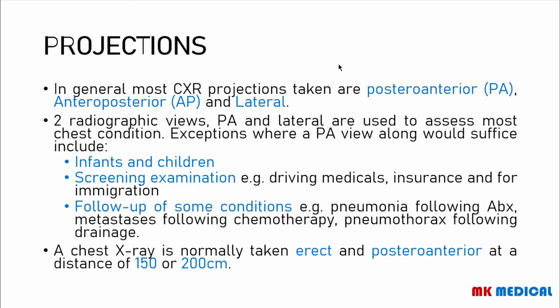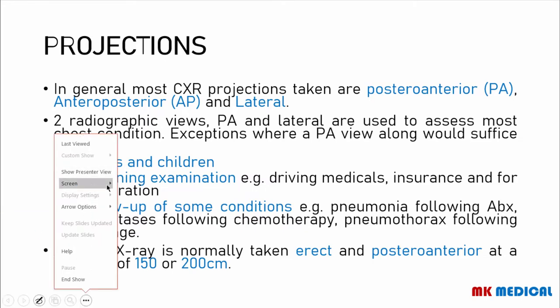What do I mean by posterior projection? Let me just show you a dark screen here so that I can jot a few things down and you understand exactly what I'm talking about. So suppose you have this as your x-ray beam. This is maybe the x-ray that is sending out a beam in this direction, like so. If the person, let's say this is a person here that's getting an x-ray, pardon my art, I know it is very, very awesome. So let's say this is a person that's facing this side. The person is facing the beam. And let's say the film is on this side of the patient.